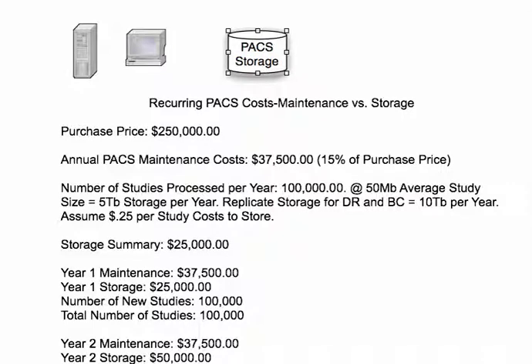In today's brief 5-minute video, we're going to look at some of the recurring costs associated with managing diagnostic study data in a PACS environment. And we're going to pick on two of those costs. We're going to look at the recurring annual cost to manage storage, to manage the long-term data preservation and archive of your diagnostic studies, versus more of a fixed cost. And in this case, we're going to look at the PACS maintenance costs.